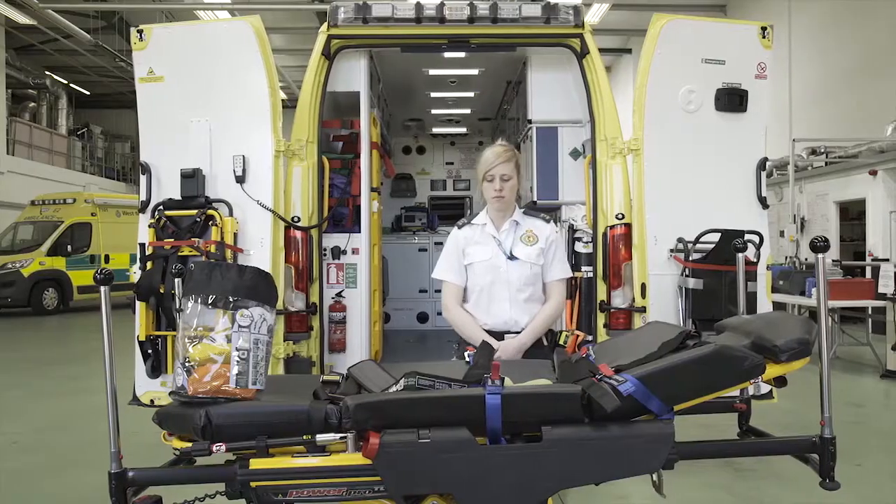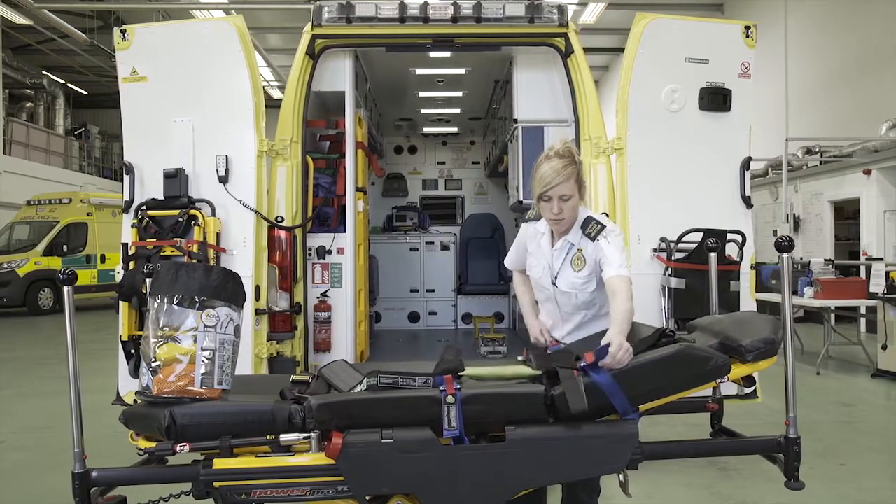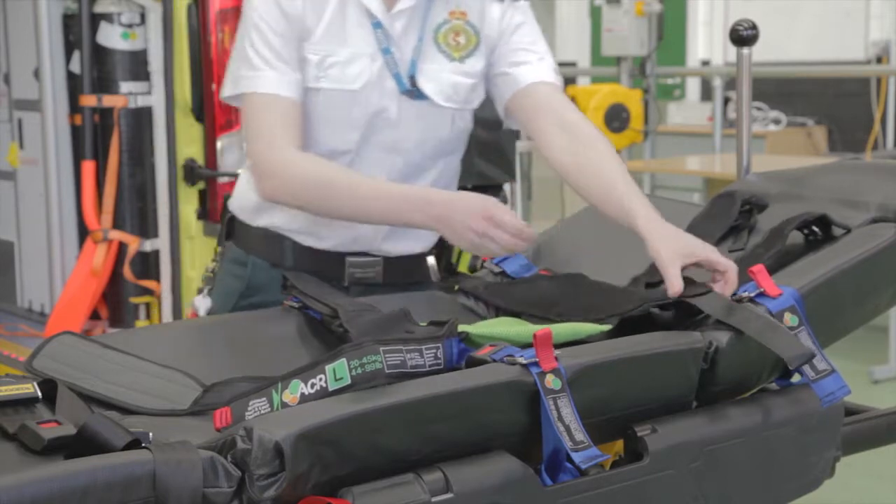Click into place the buckles on the bed mount strap to the ACR harness. Pull down each of the four blue harness straps to hold the position of the ACR on the cot. Once in place, fully open the straps located near the top and bottom of the restraint.